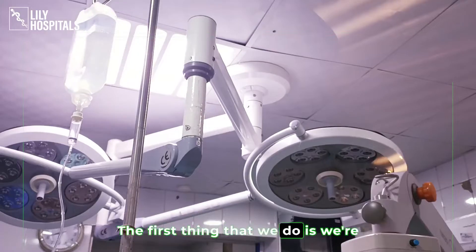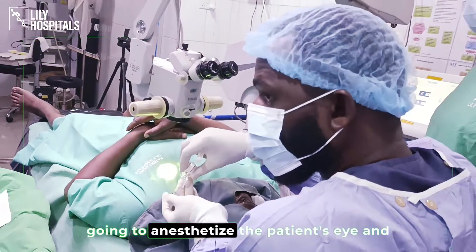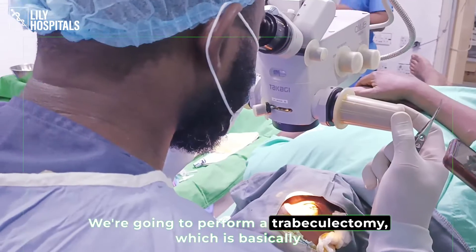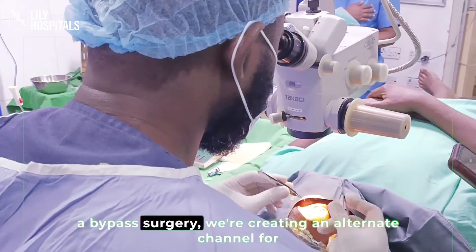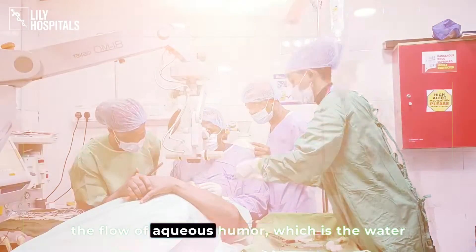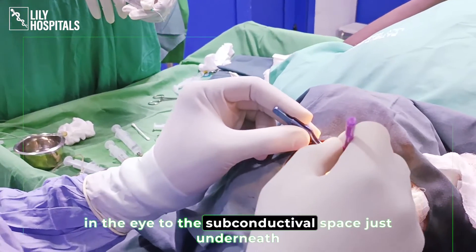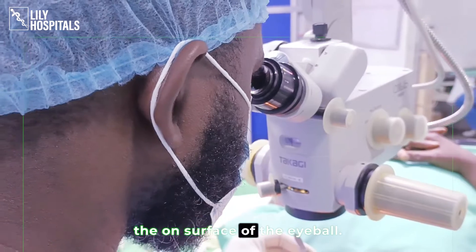The first thing we're going to do is anesthetize the patient's eye and then go ahead with the surgery. We're going to perform a trabeculectomy, which is basically a bypass surgery. We're creating an alternate channel for the flow of aqueous humor — which is the water in the eye — to the subconjunctival space, just underneath the surface of the eyeball.